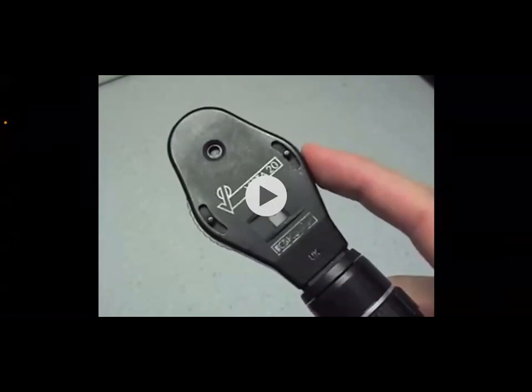Then if you are wearing an eyeglass, ideally better you remove the eyeglass. Some people might tell you do not remove your eyeglass, but if you do not remove your eyeglass, you will not be able to put the ophthalmoscope close to your eye. Ideally, the ophthalmoscope should be as close as possible to your eye. The upper part of the ophthalmoscope should touch the medial side of your nose and the lower side of the upper eyebrow. It has to be very close. If it is a little bit far, you will not be able to see appropriately.